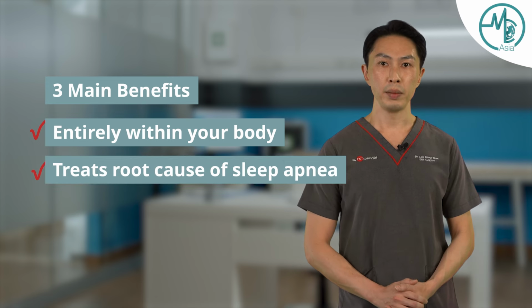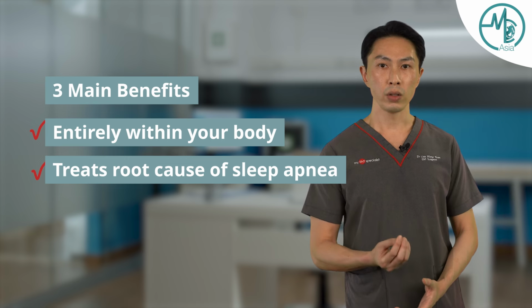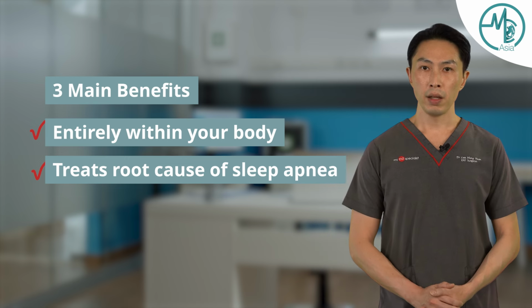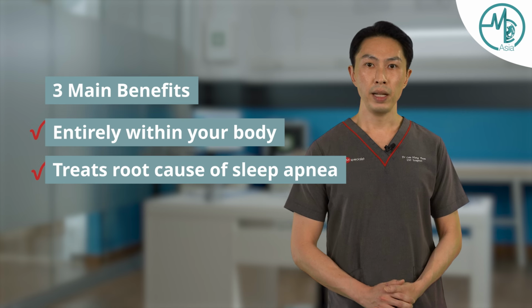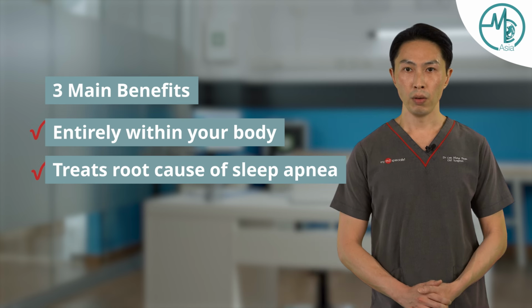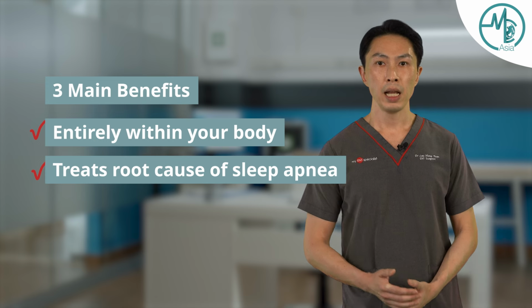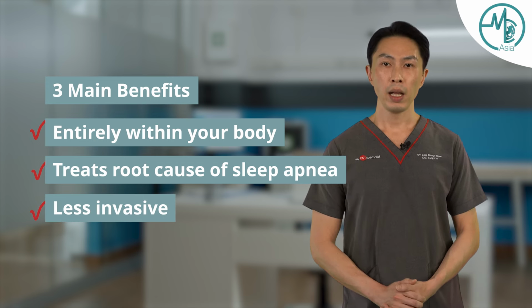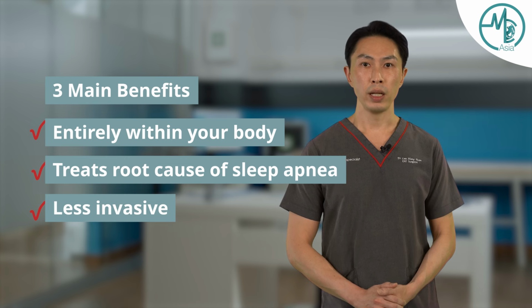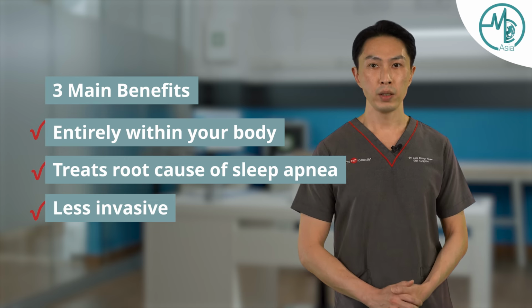The second is that it treats one of the main root causes of sleep apnea, which is the tongue collapsing backwards during sleep. So in doing so, you are really addressing the root cause of sleep apnea. The third is that unlike other forms of sleep apnea surgery, where there are invasive incisions made in the throat, hypoglossal nerve stimulation implantation is external to the throat. So it is not as painful, and also you do not run the potential risk of having airway bleeding or airway swelling, which can sometimes be very serious and life-threatening.